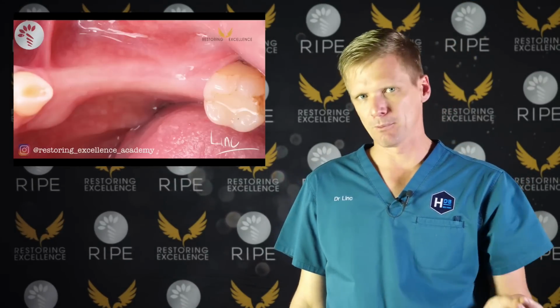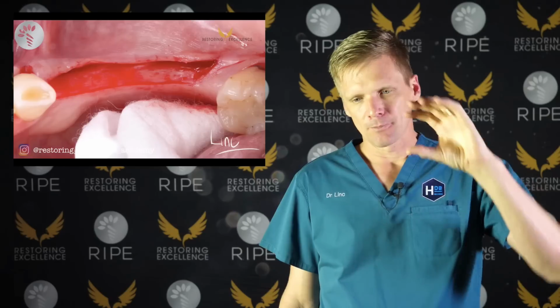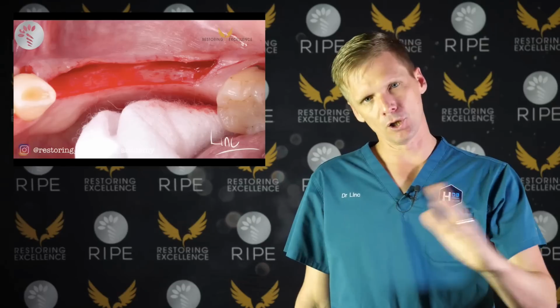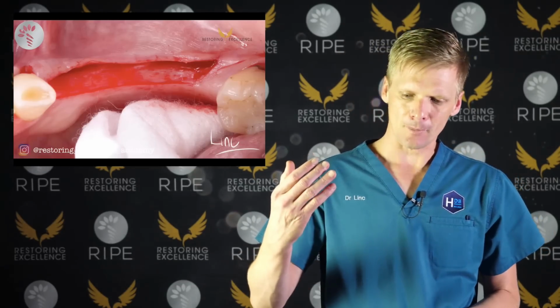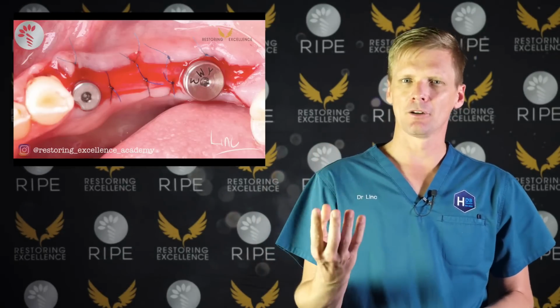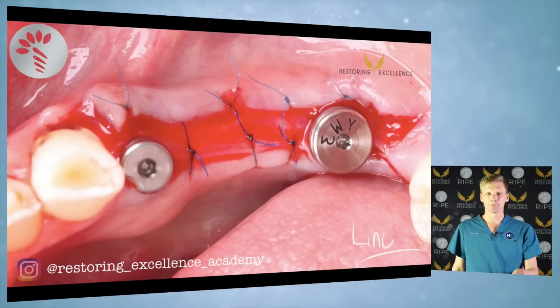Part of the difficulty with impressions is you want that really crisp capture of the soft tissue around your implants. And to do that, you actually need to have healthy tissue that's not mobile. So if your tissue is mobile or wobbly and a little bit thin, you're quite likely to get a lot of fluid coming up around the base of the abutment, and so you get these little drags there. So creating some attached tissue with implants is important.